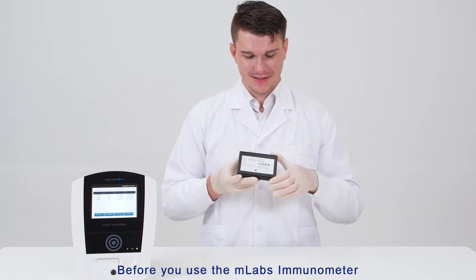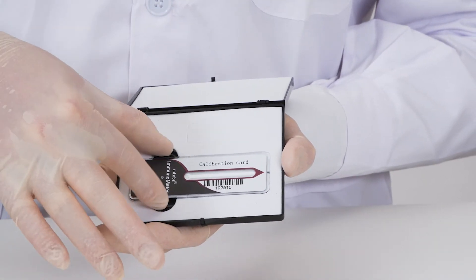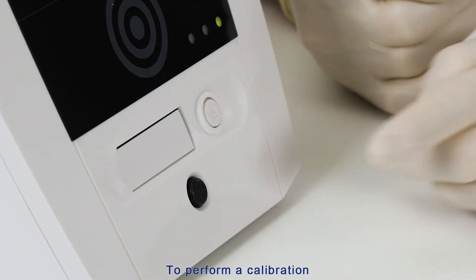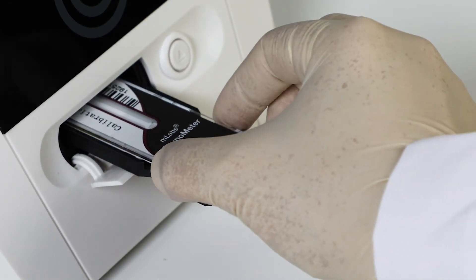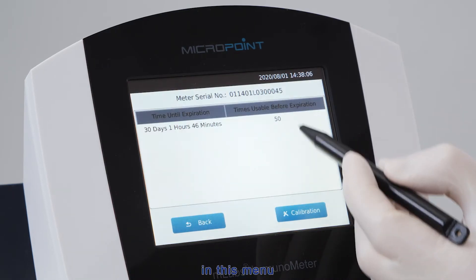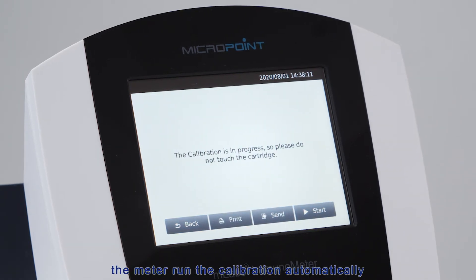Before you use the M-Labs Immunometer, you will need to calibrate the meter. To perform a calibration, press the eject button and place the calibration cartridge on the cartridge tray. From the home menu, select Calibration. In this menu, you can check the expiration date for calibration and usable times before expiration. Select Calibration and press Start — the meter runs the calibration automatically.